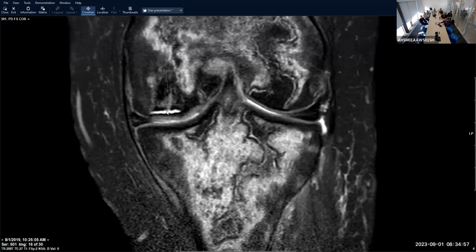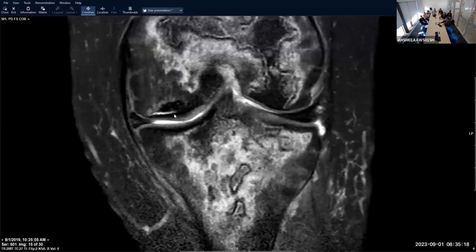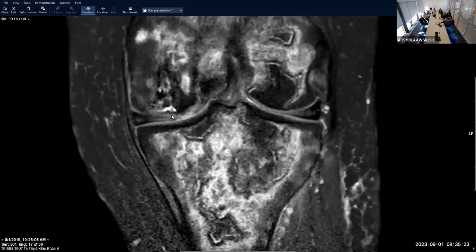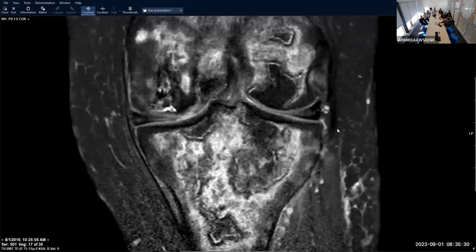In pediatric patients, there are some alternative things you can look at. If there's a single cyst subjacent to the OCD greater than 5 millimeters in size, or multiple tiny cysts, that also indicates the possibility of instability. So usually that's what we're looking for. If it's equivocal, then you could consider some serial MRIs to see if treatment would be indicated or not. So I guess that's usually how we describe it. And I try to give a size both in the coronal and the sagittal plane.